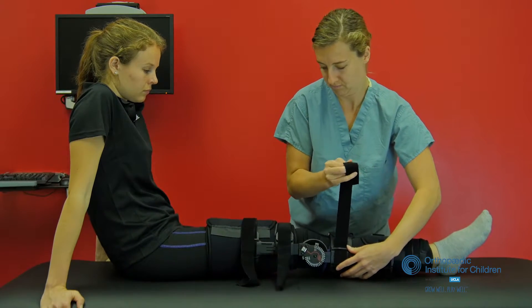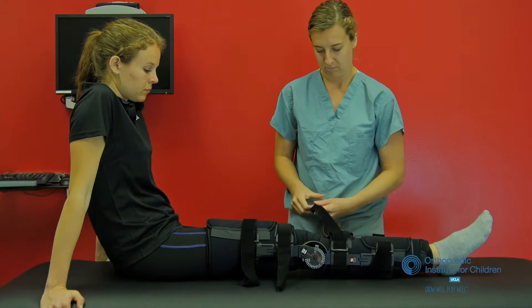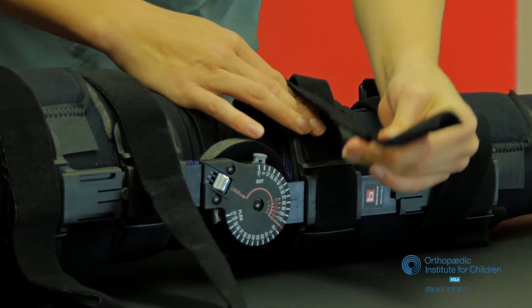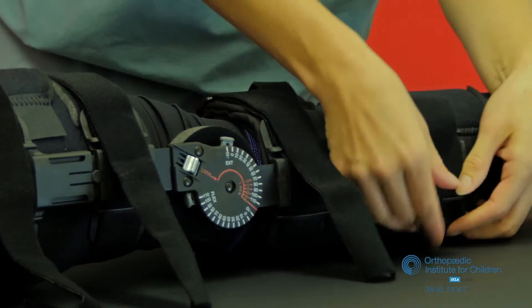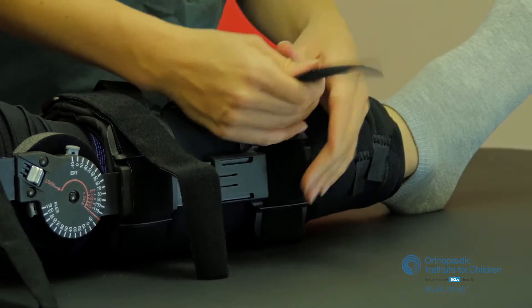Be sure not to lose those Velcro pieces as then your brace will not be able to be fastened. Your brace should remain in place at all times except when you are doing your exercises as indicated at home. If you're having any trouble with the brace, make sure to bring it up at your follow-up visit. We can answer any questions that you might have there.